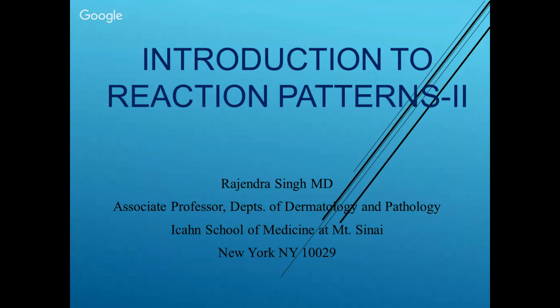We started these reaction patterns around 2 or 3 weeks, or 4 weeks back. I gave you a brief introduction of all the different reaction patterns, and then we went into how you approach each of them. So we are done with the spongiotic reaction pattern and the psoriasiform reaction pattern, and now we move on to the next one. For all these reaction patterns, as you know, all the slides are available online, so you can go and look at these slides online.